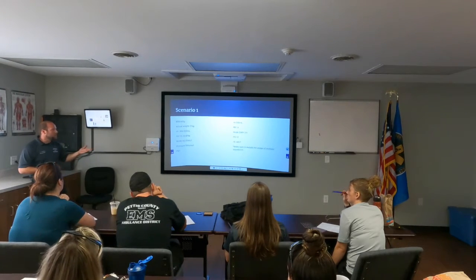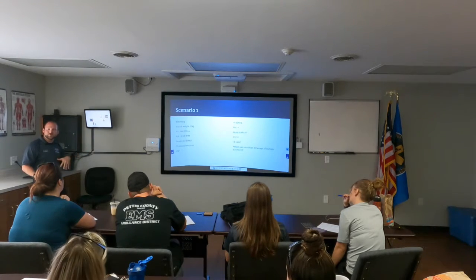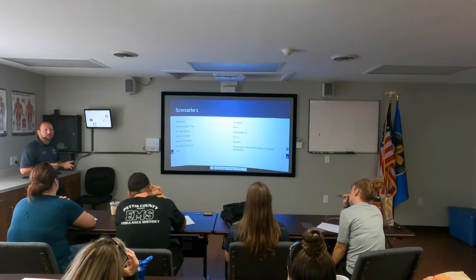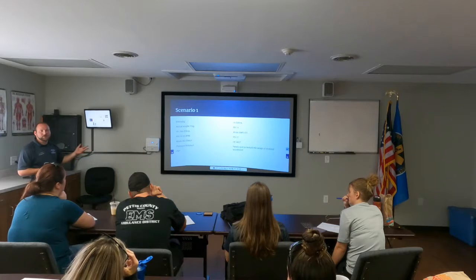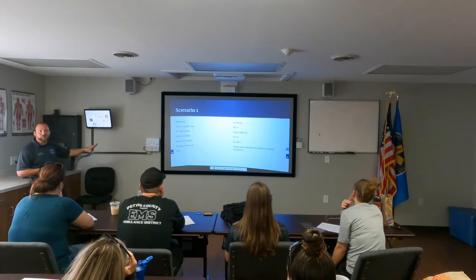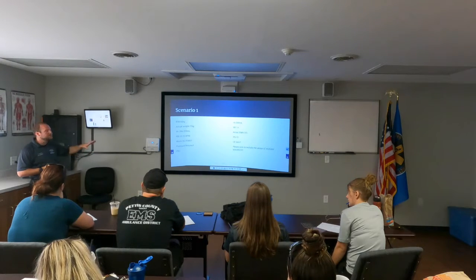Are we going to be doing more of a pressure support with her, or as far as are we doing a pressure control, or are we going to be doing more volume control with this one? Pressure should be trying to open her up. Yep, either one actually doesn't really matter. For this individual, I would start with AC mode volume.